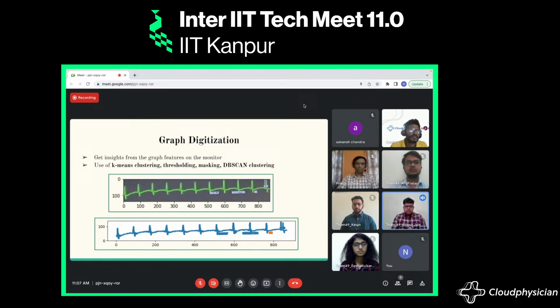Yeah, so talking about the graph digitization part, the process of digitizing the heart rate graph in the image involves several key steps. Firstly, the relevant portion of the image that contains the heart rate graph is cropped using the provided bounding box coordinates from Model 2. Subsequently, a thresholding technique is applied to differentiate the graph lines from the background by determining the color of the graph lines using the k-means clustering algorithm. Then the binary image is further processed using a morphological close operation to define the graph lines and remove small gaps. The coordinates of the graph lines are then extracted, stored in a data frame, and duplicates are removed.